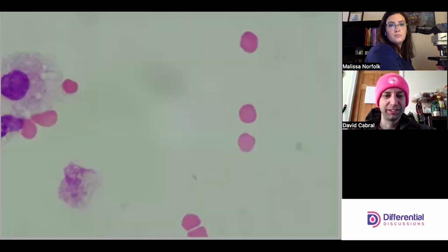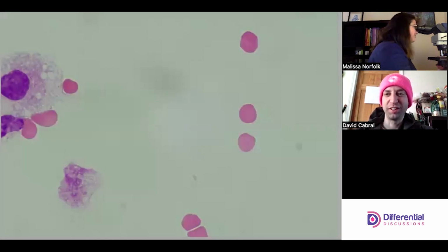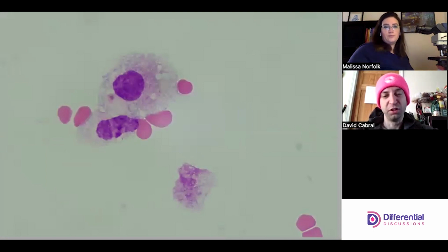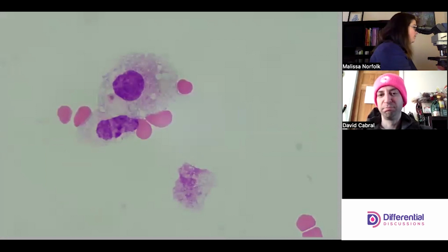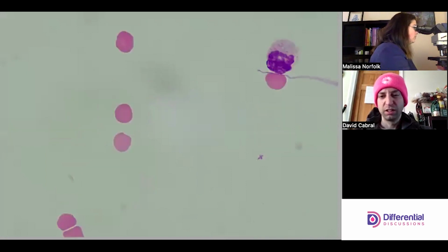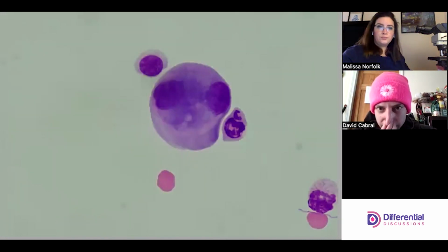Hi, red cells. Well, we know the stain quality is good. That's a good QC check, right? Our red cells are staining beautifully the way we expect, and our nuclei and nucleated cells are staining like we might expect. So that's good. So two monomacs. Yep, cleanup crew is in the house.